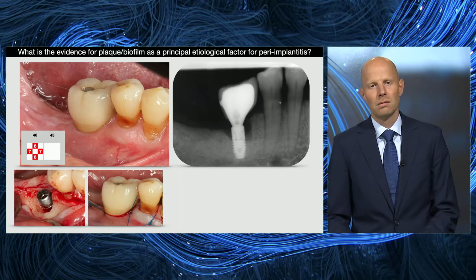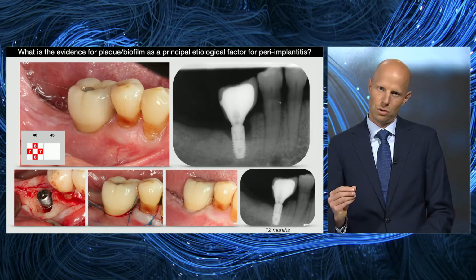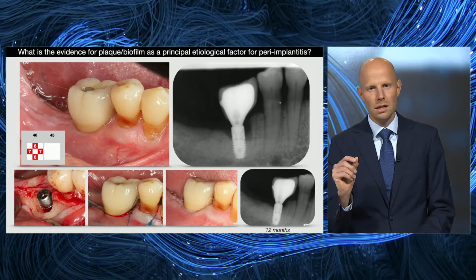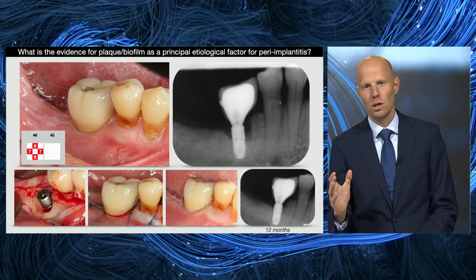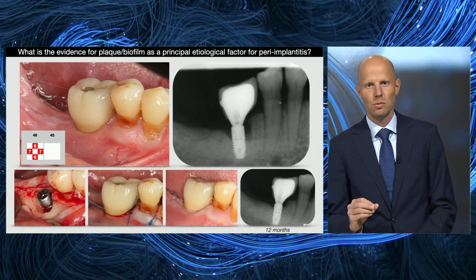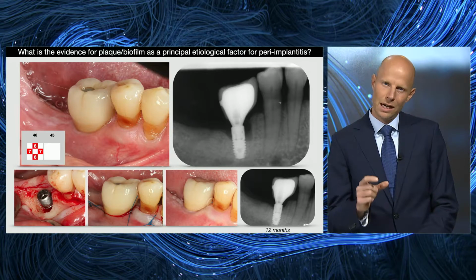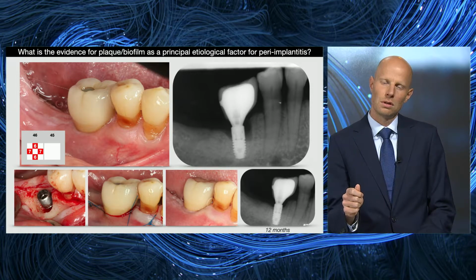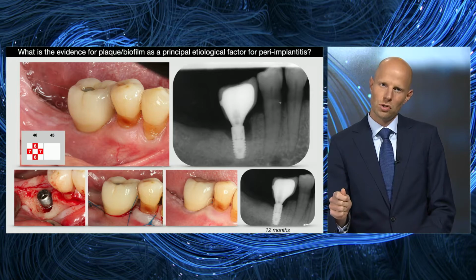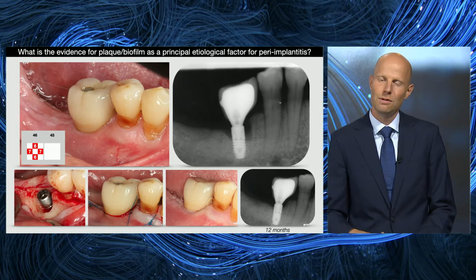If we then allow the case to heal, and I'll show you here a follow-up at the 1-year assessment, we see that first and foremost we get rid of the deep probing depth. There's an absence of bleeding on probing. And in line with the clinical improvement, we also see the response on the radiograph. That is, we have a remineralization, a defect fill.